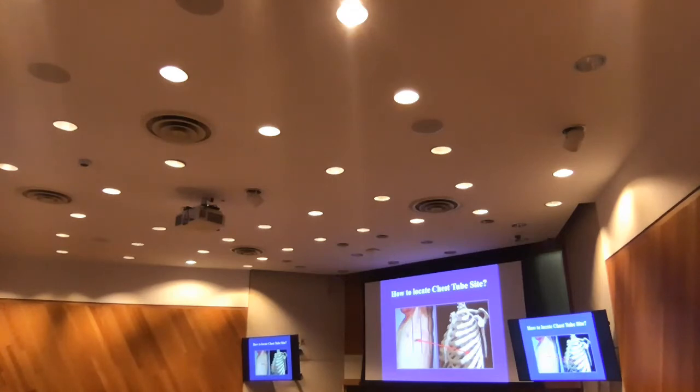So what was the number of ribs when we put in the intercostal catheter? Three. And now we're doing 3 plus 3, six. So most chest tubes will be inserted over the sixth rib. I like the fifth intercostal space. Yes, it will be the fifth intercostal space, so if that was your answer, that was correct. But the rib is sixth, because first intercostal space, second space, third space.